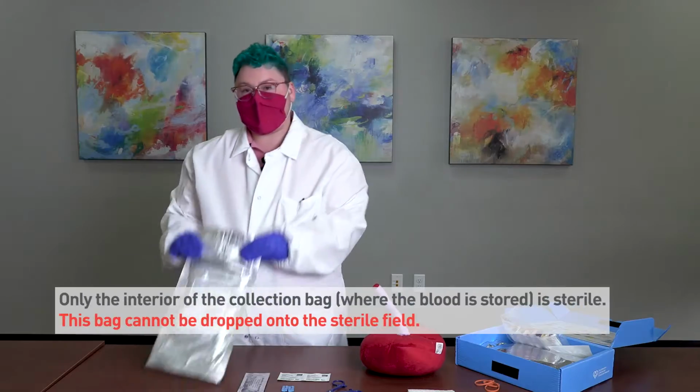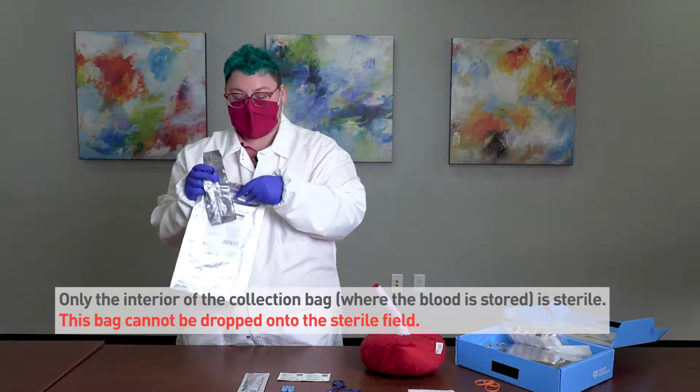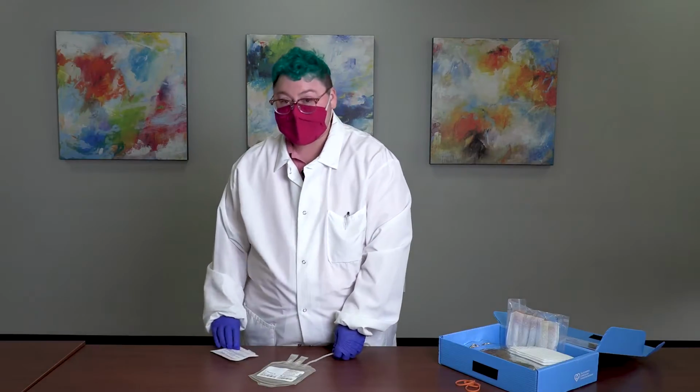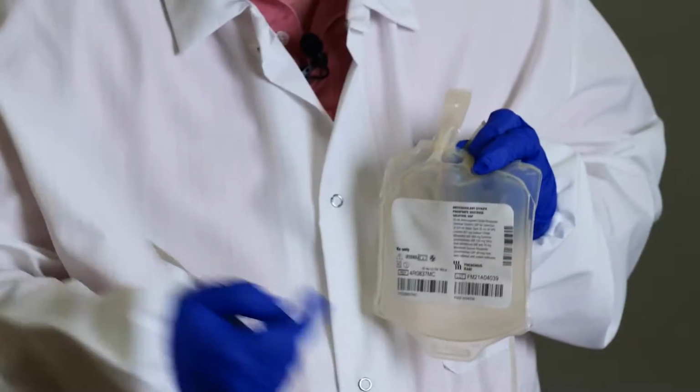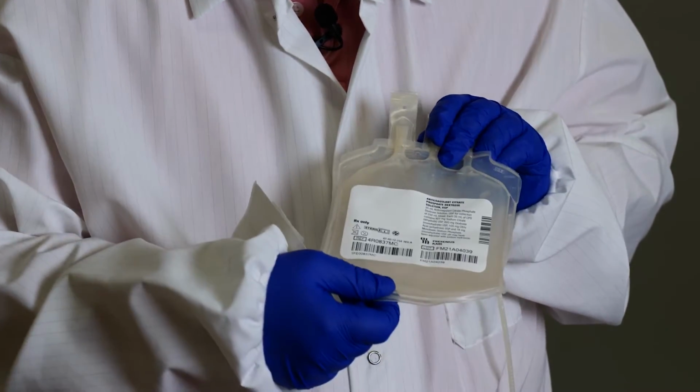When you're ready to begin the collection, you go ahead and open the collection bag. Once this bag has been opened, it must be used within 24 hours. Before the collection, you'll want to add the base label to the collection bag. The base label notifies our lab staff that this is cord blood because this collection bag does not indicate that it is cord blood as opposed to adult blood.